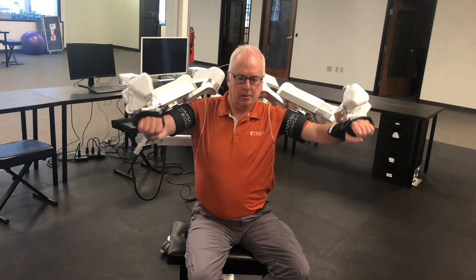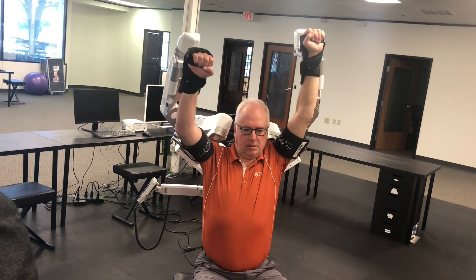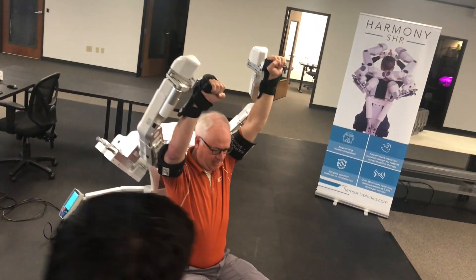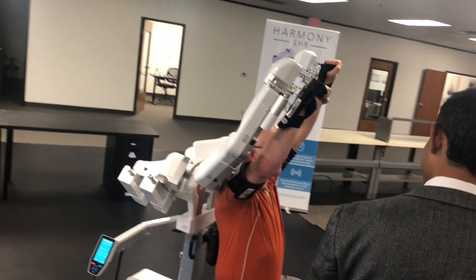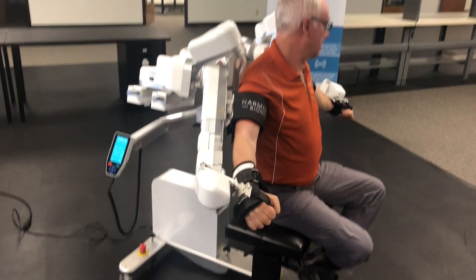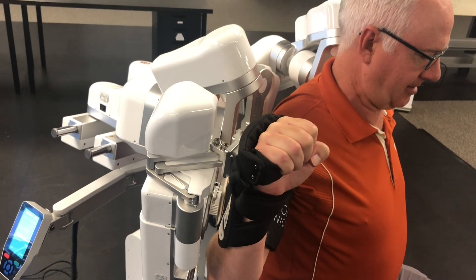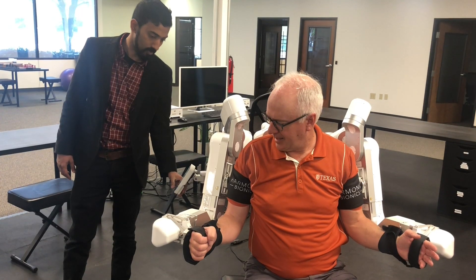Now with lefty's help again — how high can it get? Oh yeah, that's all the way up. You can also take a picture — this is your money figure. Again with lefty's help you should be able to go upwards a bit this way. Oh yeah, that feels like all the way back. It's super even. Say end session.